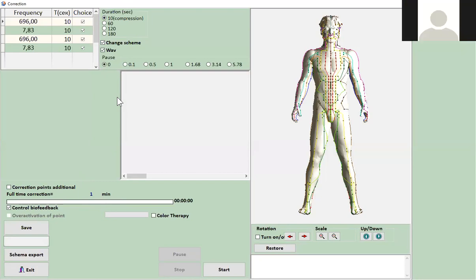And where did you put the magnetic strip? Did you put it on the machine? Now we'll show you. Can you see us at least a little? A little, yeah. So on this one, if you have this device that is separate from this box, this is the box, and this is the device that writes down the frequencies. Or it should be inside. Does it matter which side up it is? If you have it separate, you have to take the side that locks on.